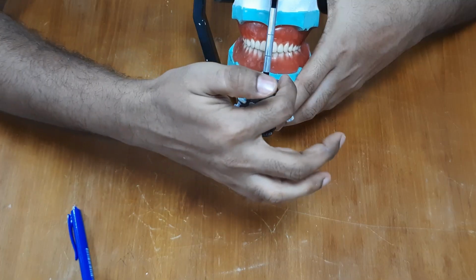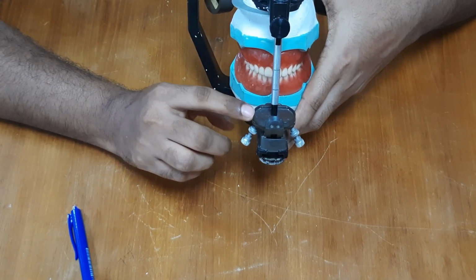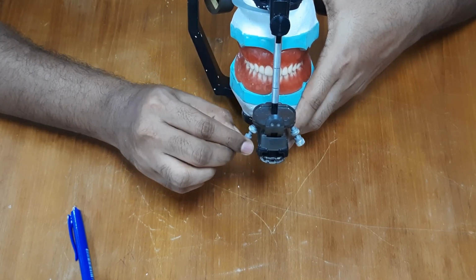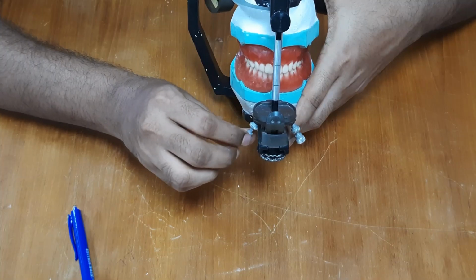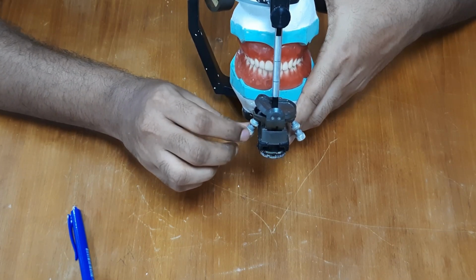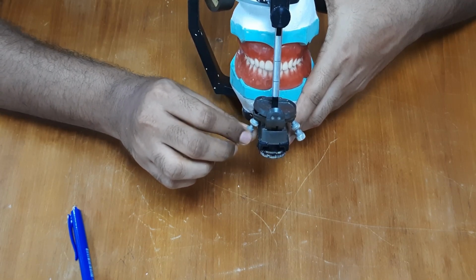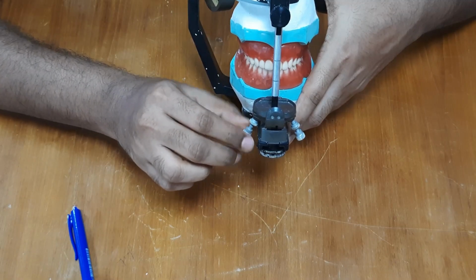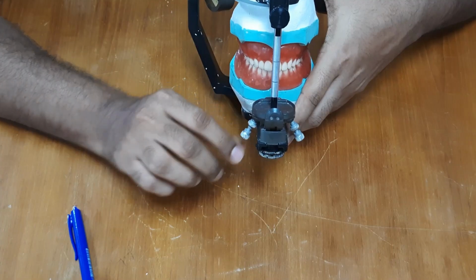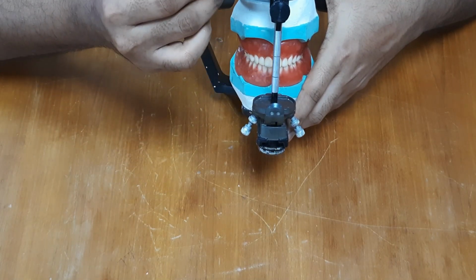Also, it has two lateral wings, right and left lateral wings. The inclination of the wings also can be adjusted using the thumb screw and the thumb nut. This can be adjusted from 0 to 45 degrees on either side. This can be used for setting the protrusive and lateral incisal guidance. There is an incisal pin attached to the upper member.